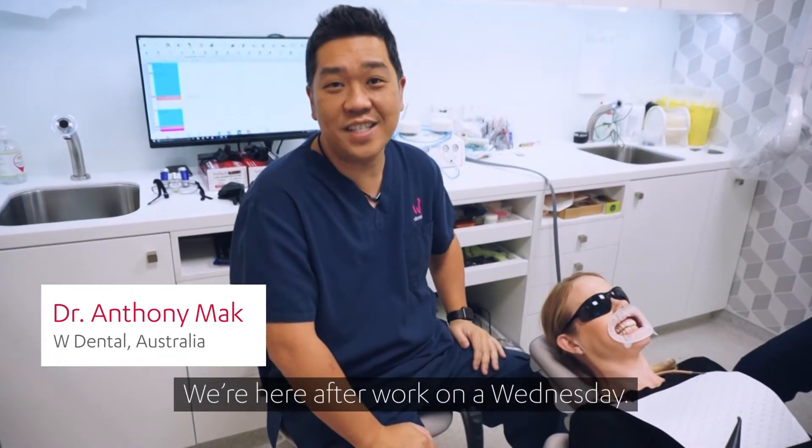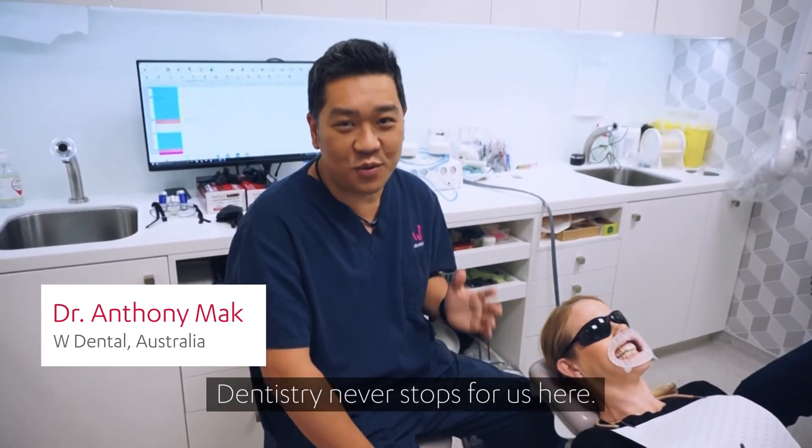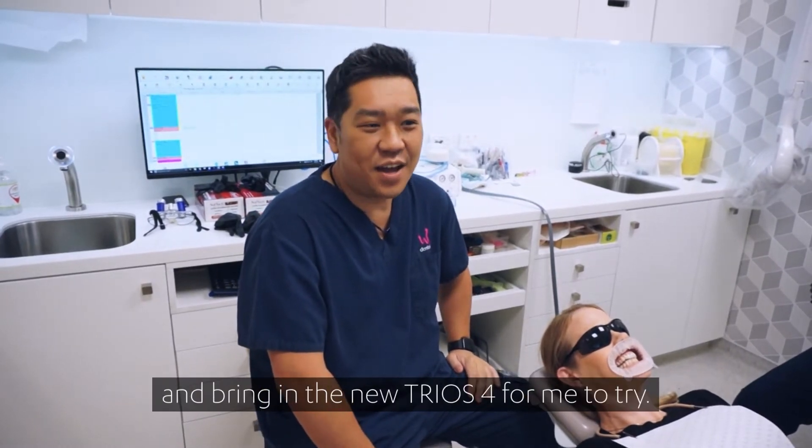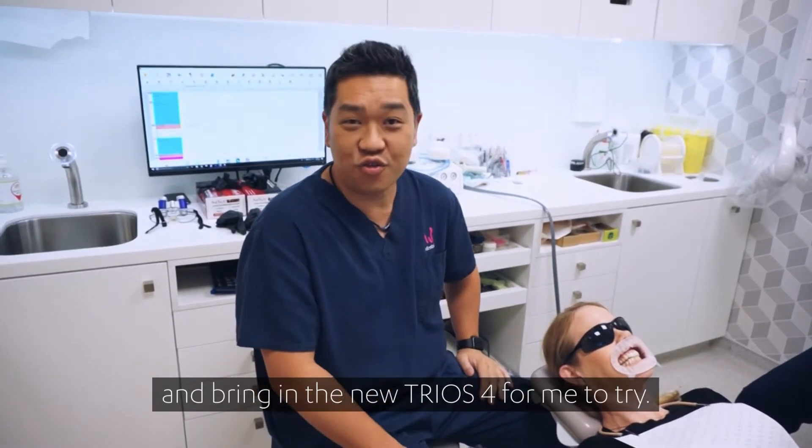We're here after work on a Wednesday — dentistry never stops for us. Three Shape decided to pop in and bring the new Trios 4 for me to try.